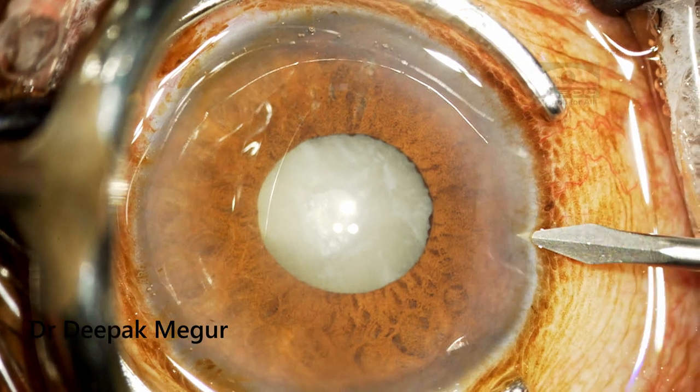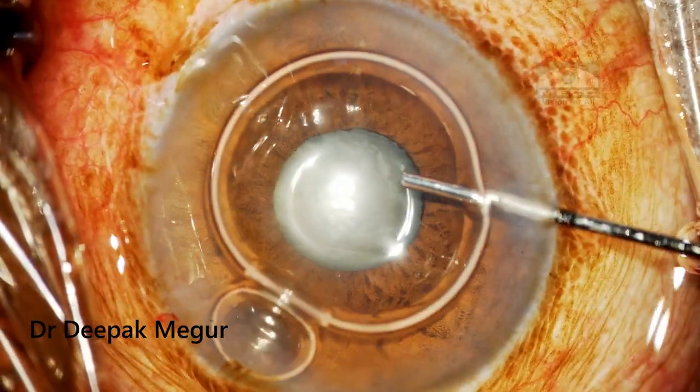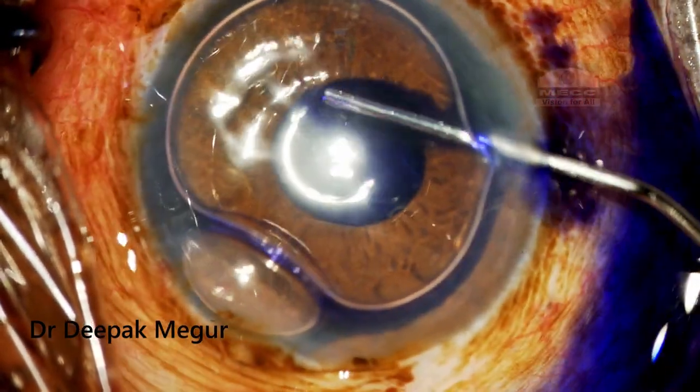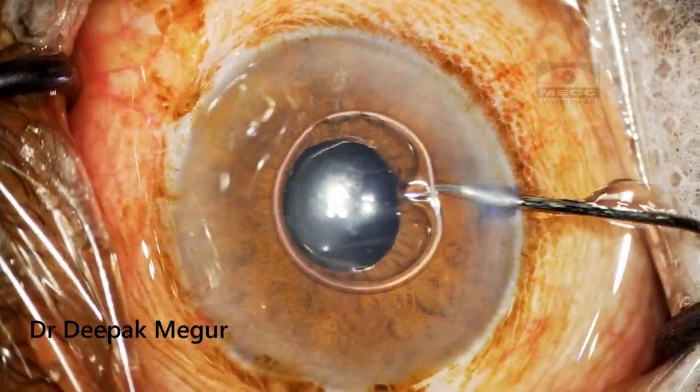I made the side port incisions and it is quite tricky to stain the anterior capsule in small pupils because sometimes the peripheral capsule will not get stained. One trick is to go under the pupillary margin and inject the dye so that the peripheral part of the capsule under the pupil also gets stained.